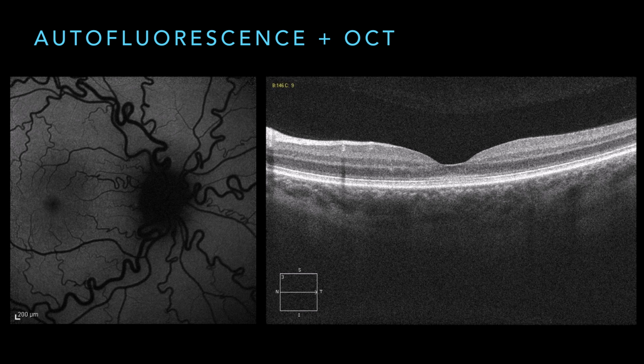Most likely she has a cone rod dystrophy. She also says that her father, her paternal grandmother, and that lady's mother all had vision problems that started in their 40s. So spectral domain OCT is amazing. These findings couldn't be seen on Stratus or time domain OCT.